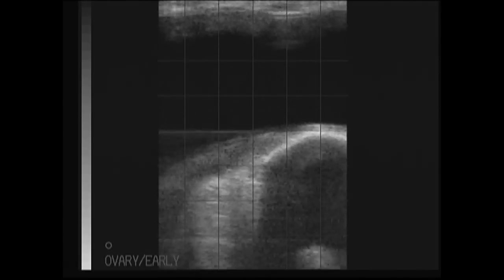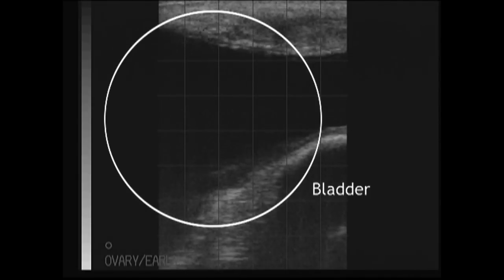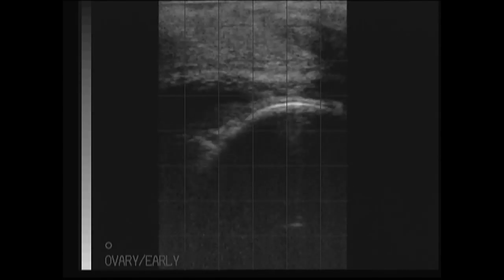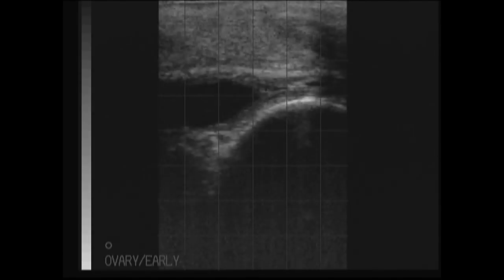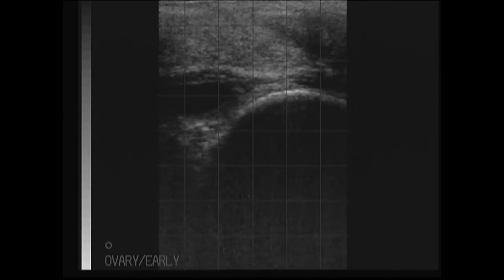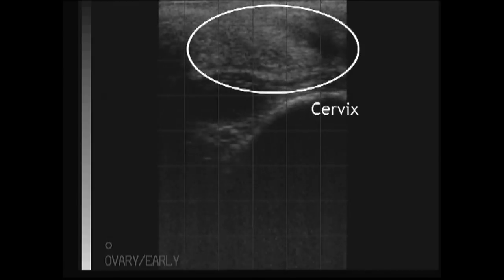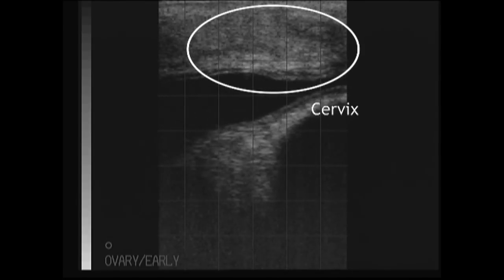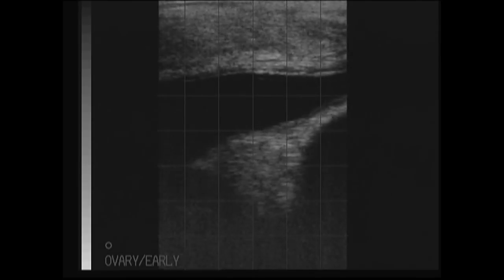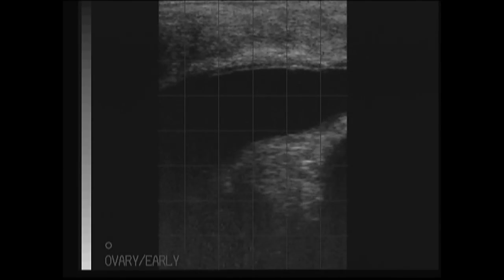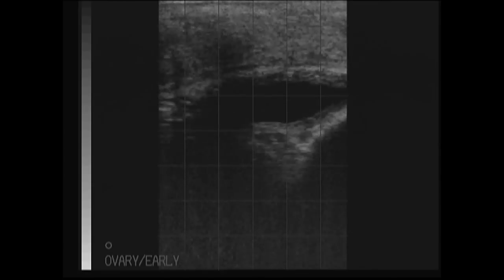Currently we are viewing the urinary bladder of the cow. This should not be confused for the presence of a pregnancy or fluid filled uterine horns. What we can see at the very top of the screen is the cervical region, which is a tubular structure that is soft tissue and hence the gray appearance on the ultrasound image.